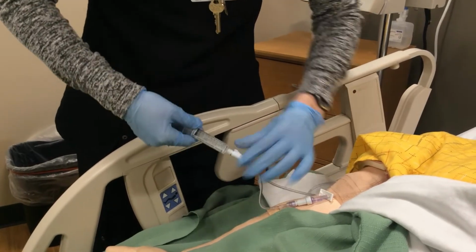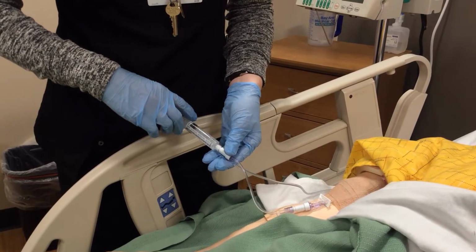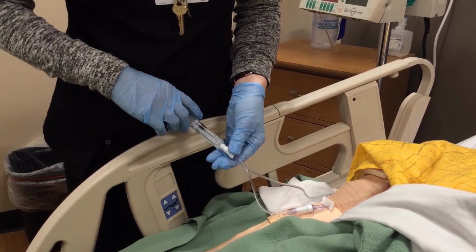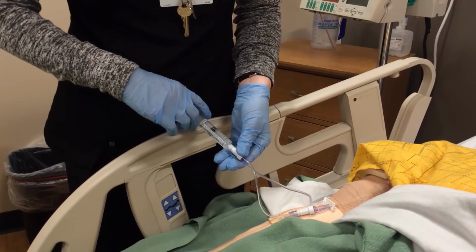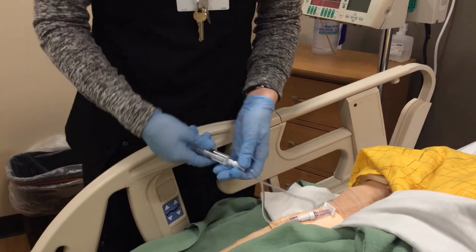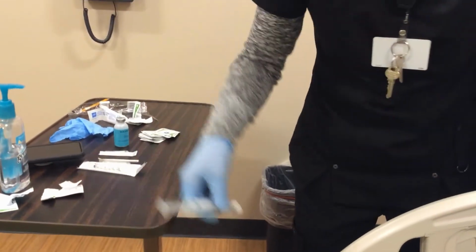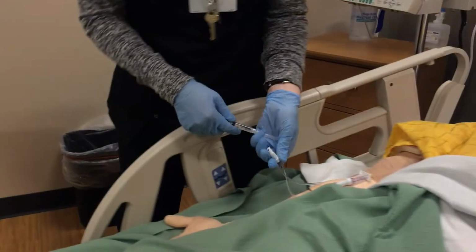Catch it. And my policy stated 5 ml. So I'm at 10, so I'm going to go ahead and push it to the 5. Feel okay, Colin? He says, yep, feels just fine. Good. Okay. I'm going to go ahead and recap it because I want to use that as my flush afterwards.